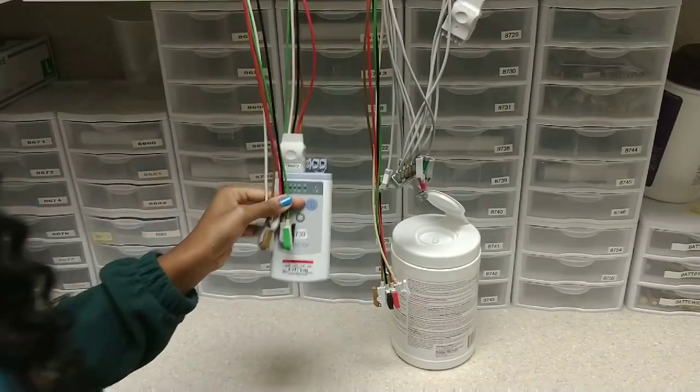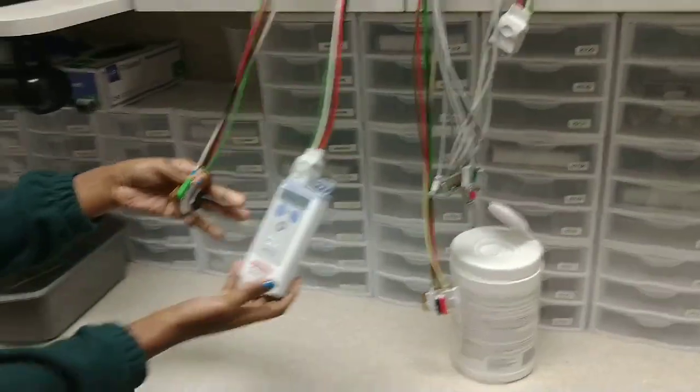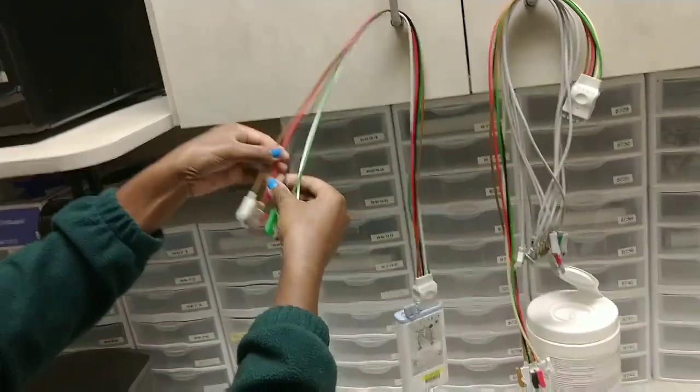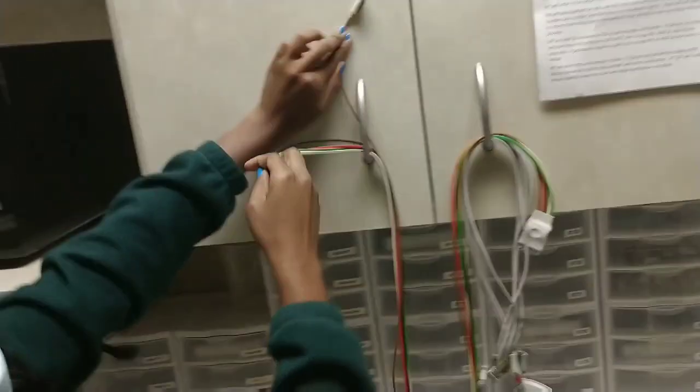How come the wires are different colors? Because they go on different places on the patient. So this one goes in the middle of the chest.